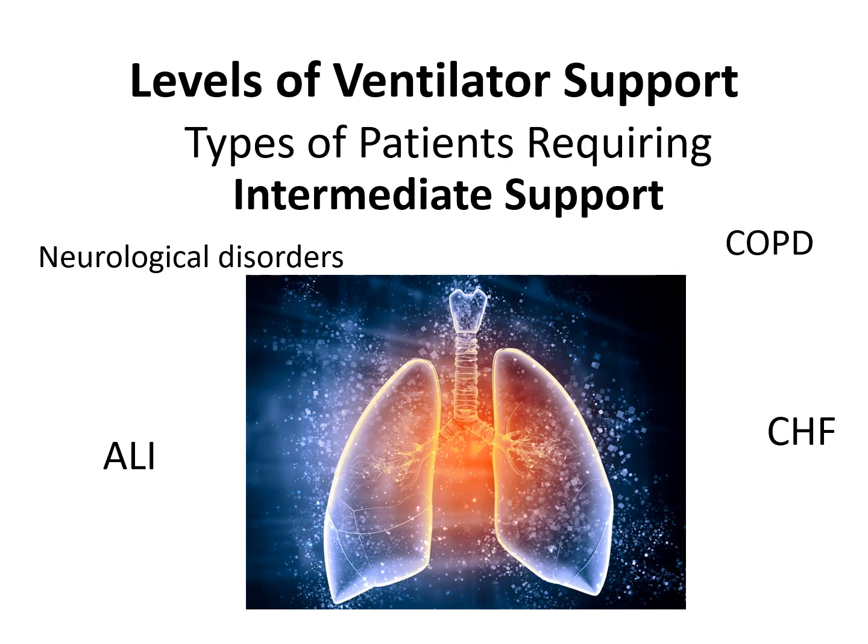The most common level of ventilator support until the patient is ready to be weaned is intermediate support. As we're trying to pull the support back a little bit, you'll notice that there is some overlap in certain conditions like ventilator modes, but it's not one size fits all. Different types of patients require intermediate support. They may be able to breathe on their own, but they just need a little bit more support, such as those with neurological disorders. They have irregular breathing due to changes, like increased cranial pressure. With head injuries, they may have erratic breathing and need just a little bit more support.